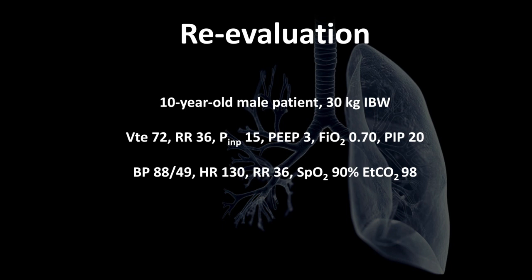It's because now they've never addressed the inspiratory phase. Inspiratory phase is still very short. They're still not getting enough volume into the lungs. They are hypoventilating the patient. So why is that? Why has end-tidal CO2 climbed? Picture that. Well, look at the tidal volume. Tidal volume is significantly low. We're not even reaching half of what it should be. So they are trying to go back to the basics. They've increased that respiratory rate. They've doubled it, over doubled it. The response has not been what we thought.